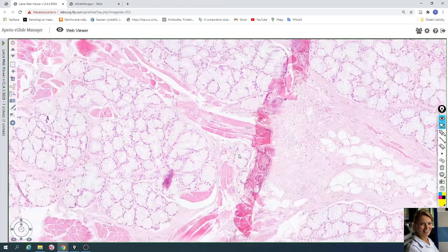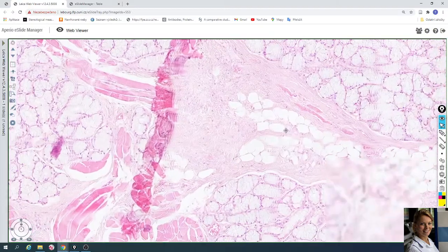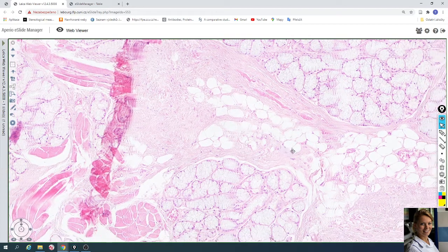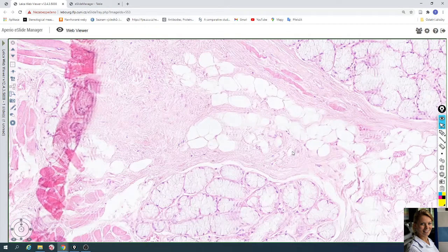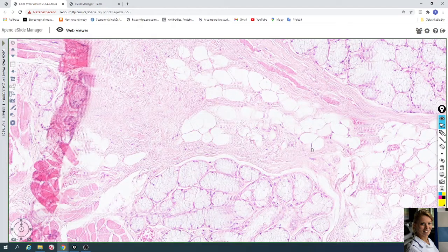You can also find adipose tissue. Here are fat cells, which also have a peripherally located nucleus.